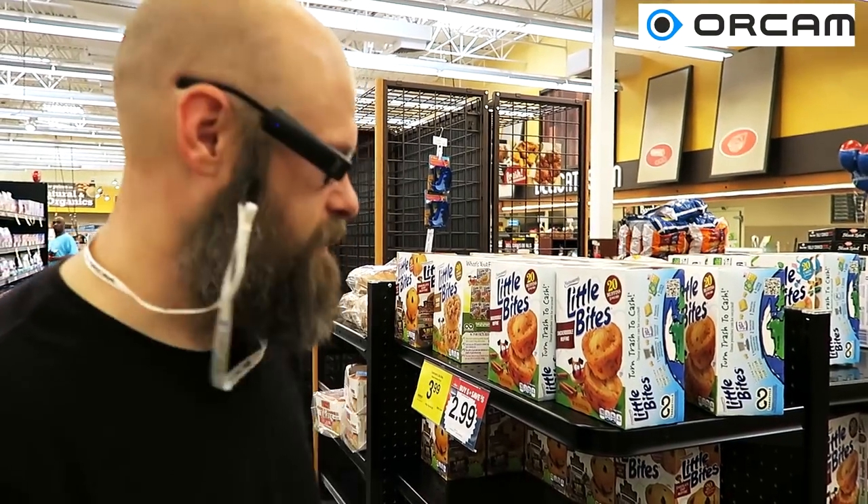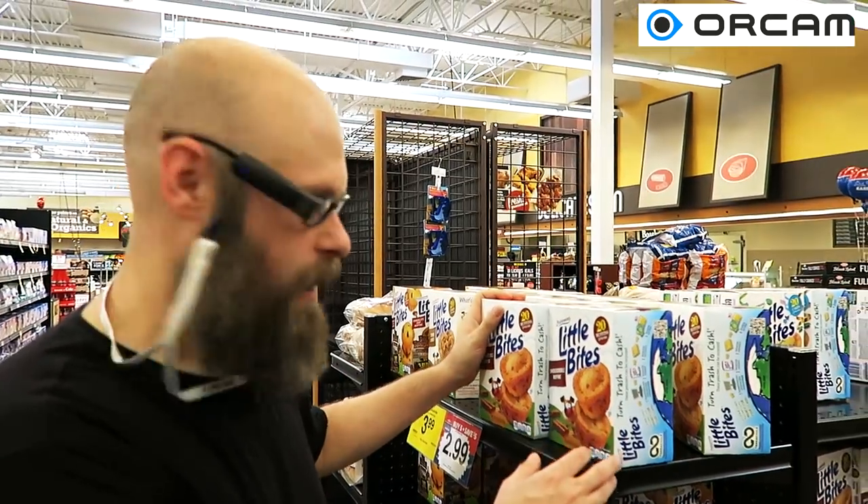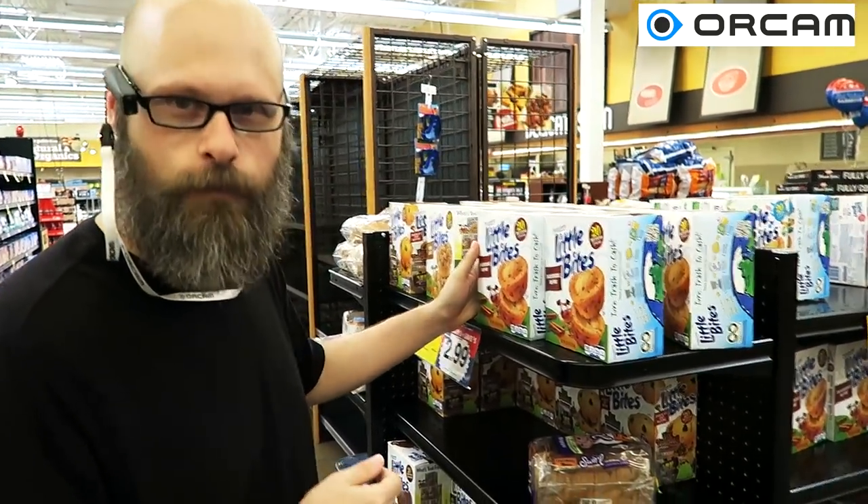Okay, so here's our first test. We have these boxes of muffins. I can tell what they are but I can't tell what flavor they are, so I'm going to use the OrCam here to see if it'll read the flavor.